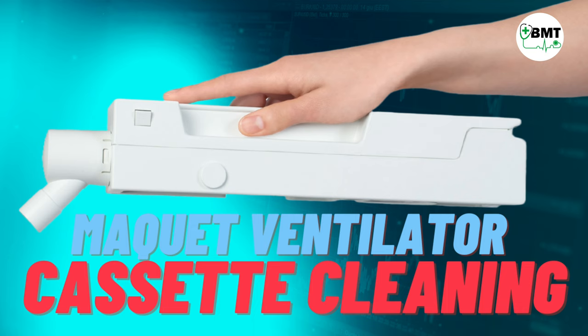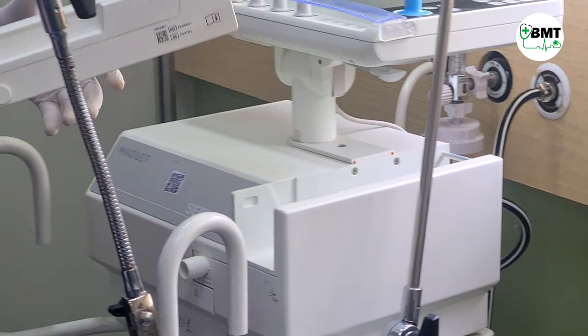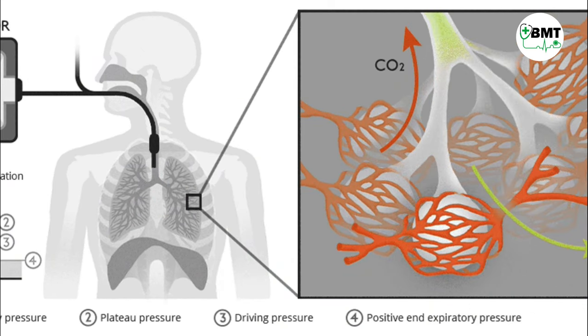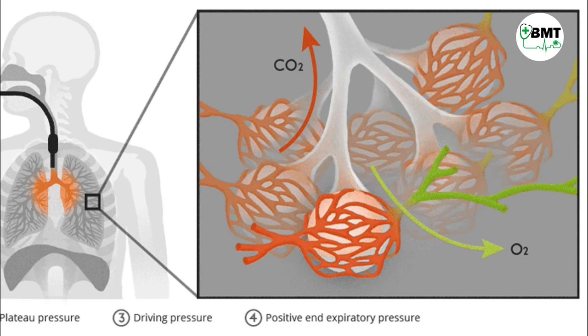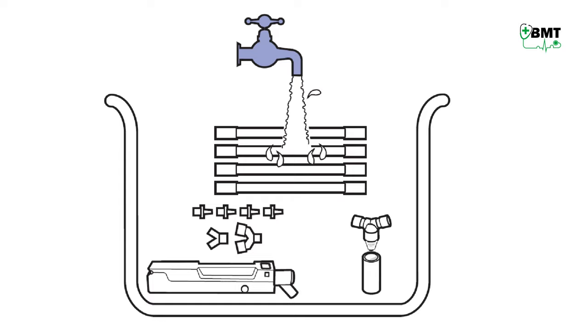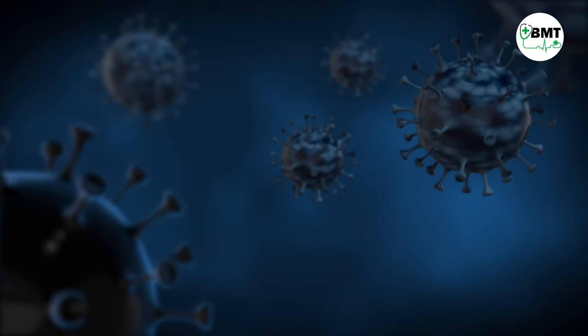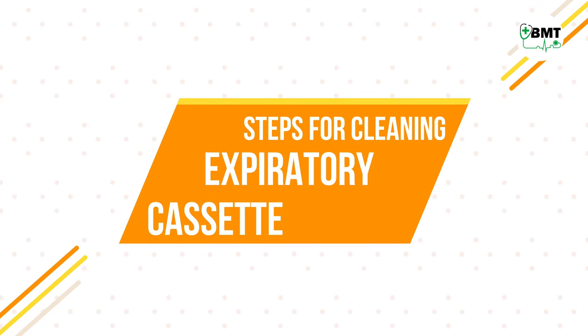Maquet Ventilator Cassette Cleaning Steps. The expiratory cassette is a component of ventilators which measures pressure, flow rate, and other important values of gas passing into the lungs of a patient. It is important to rinse the expiratory cassette thoroughly after it has been in contact with a patient with infectious diseases, e.g. TB. Steps for cleaning the expiratory cassette are as follows.